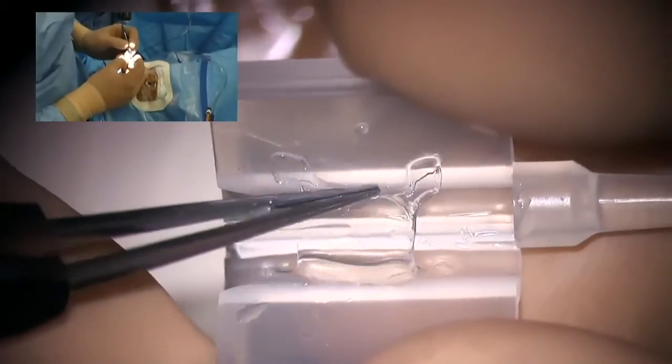You can see here that I'm trying to buckle up this IOL. This is because normally it's easier to unfold the IOL properly in the AC, but you can also do it the other way around. You have to be very careful not to incarcerate the fine haptics inside this cartridge. You always have to check this prior to the implantation.